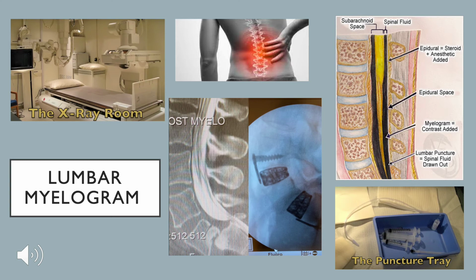The radiologist sees the fluoroscopy image, guiding the needle to confirm good positioning for contrast material to be injected. After succeeding, the X-ray table is tilted in different directions, allowing contrast material to travel all throughout the spinal cord.